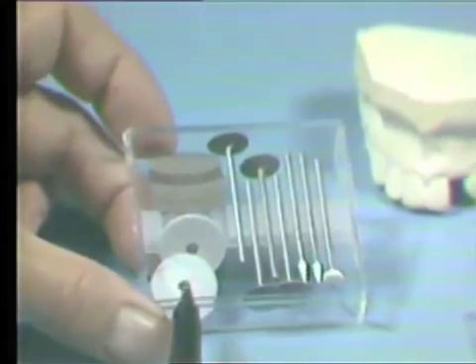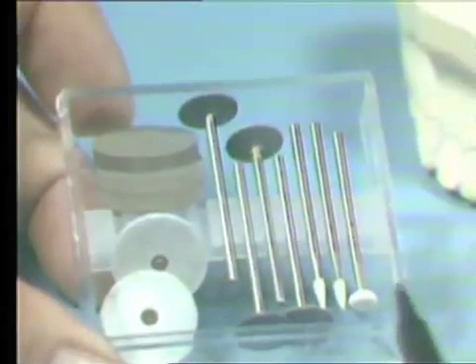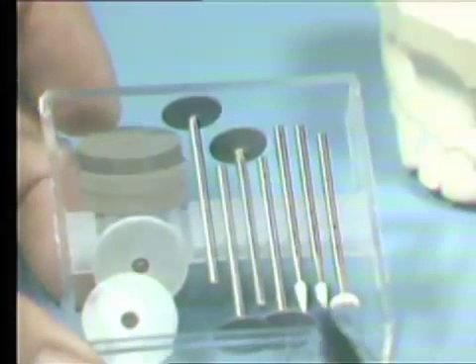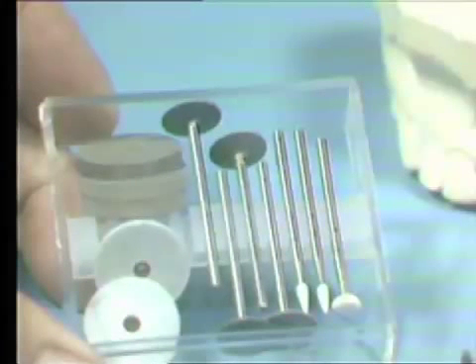In the custom porcelain polishing kit, there are two large green stones for gross reduction of the ceramic veneer. The series of small white stones consists of one biscuit shape and two pointed stones. We use these for the subtle details, the incisal edge, and surface contouring.